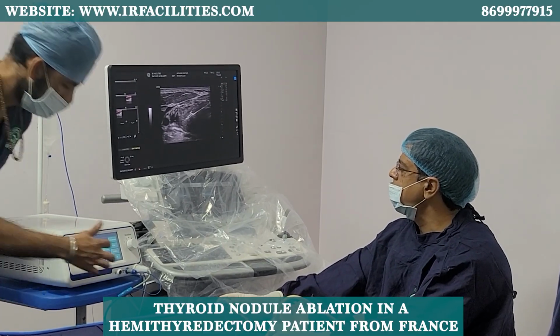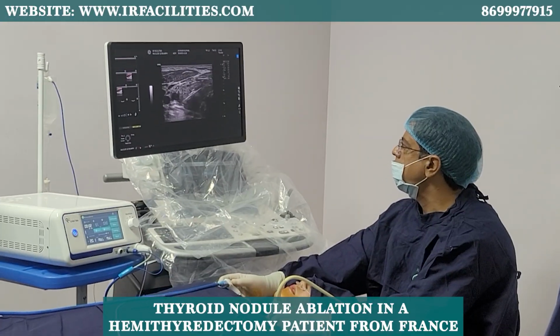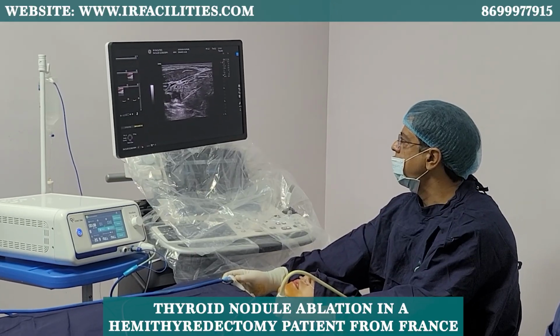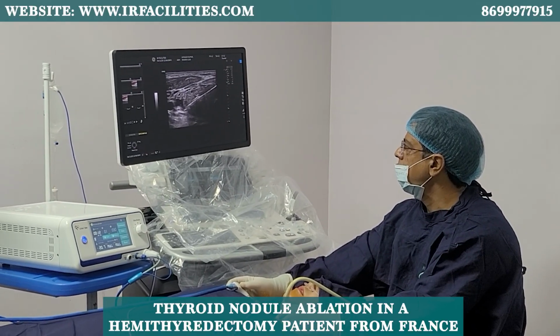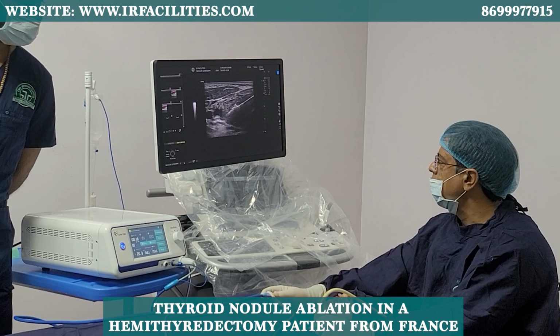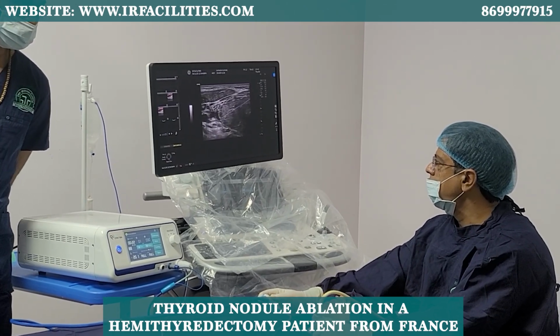Just 30 seconds. I can decrease the wattage, but if you don't have pain, then it's okay. Have pain? Should I stop? It's okay. Just 30 seconds. 20 seconds are over.